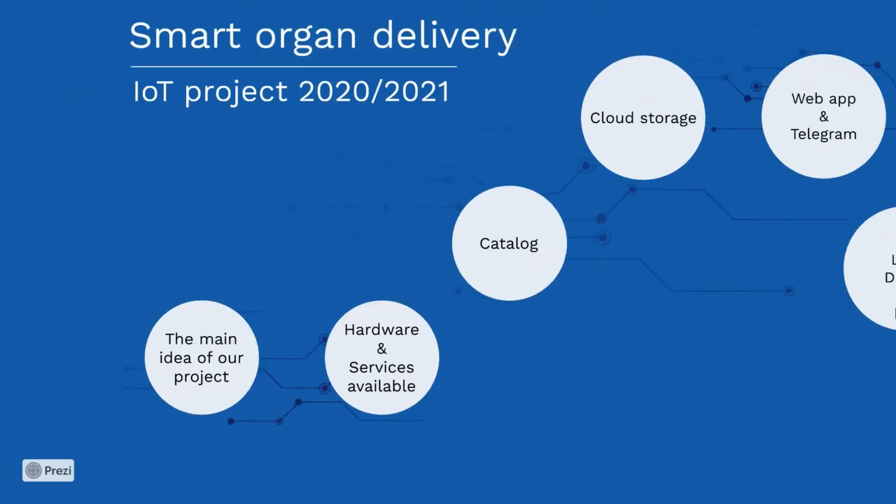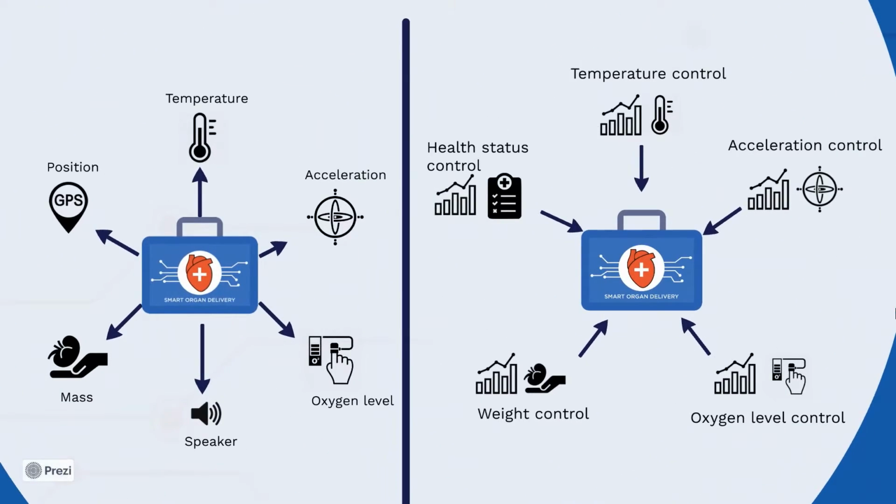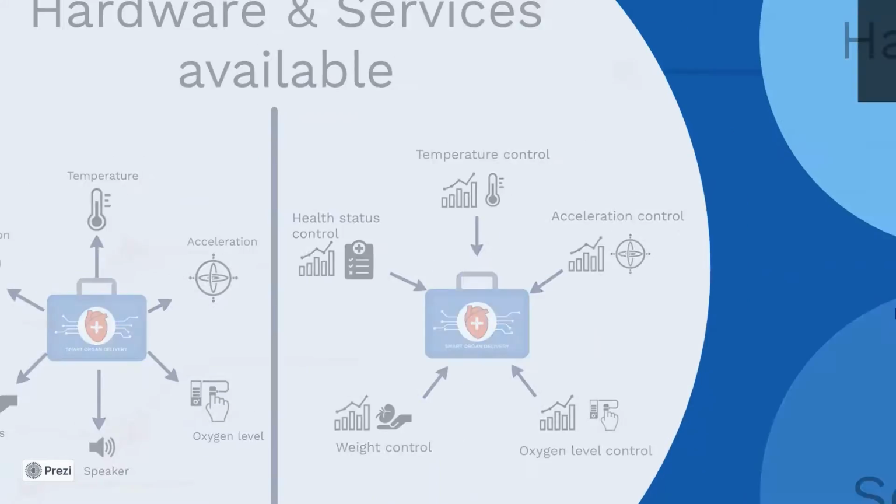The smart platform includes a box containing several simulated sensors on which various services are made available for data monitoring. We will now describe the structure of the hardware and all the services. Then we will analyze how they communicate and exchange information through the catalog.